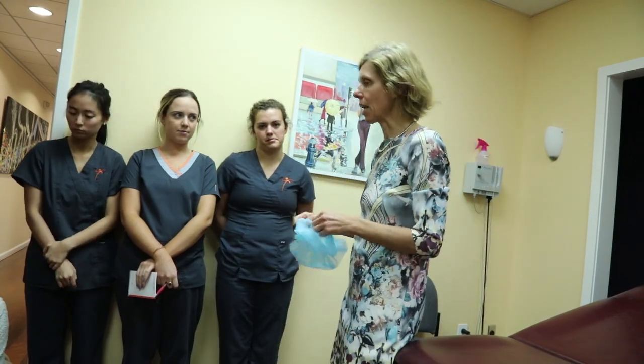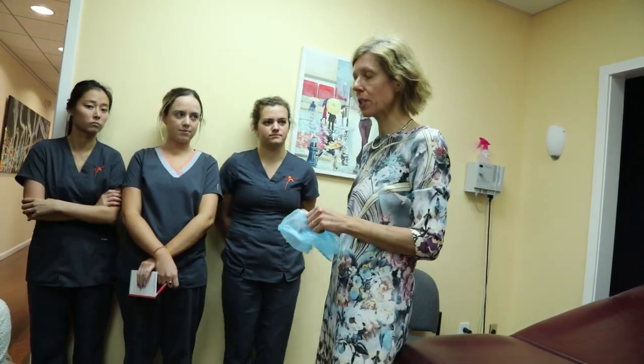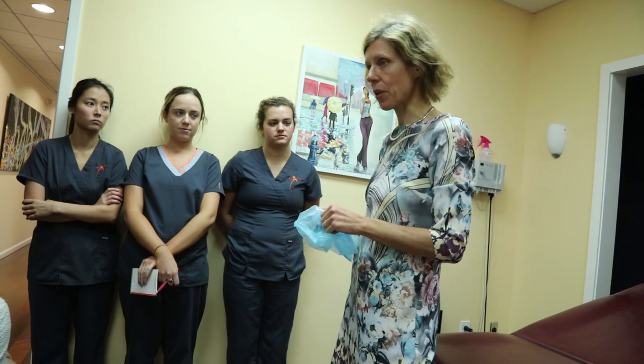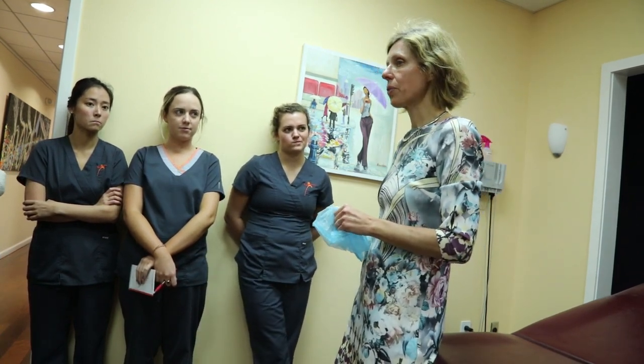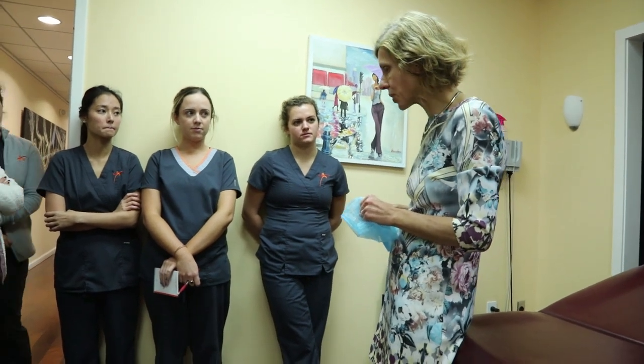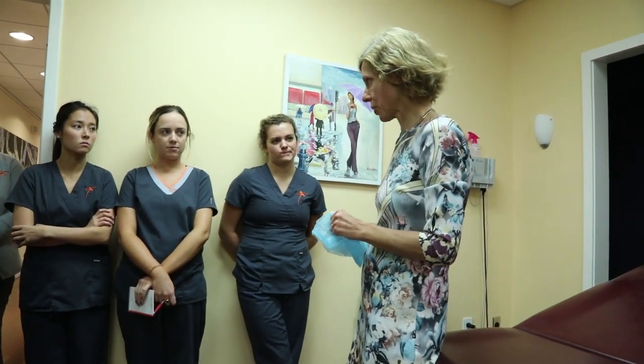Talking today about PDT treatment and how to do it properly. When you greet your patient, if it is PDT for the face, you're first going to be asking the patient to have some photos taken.